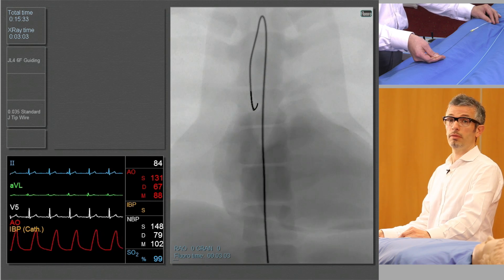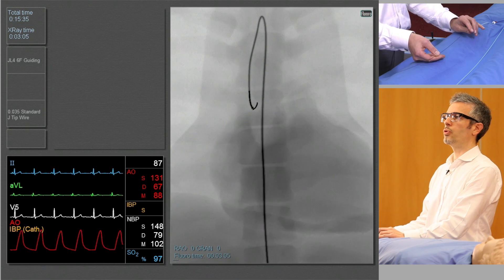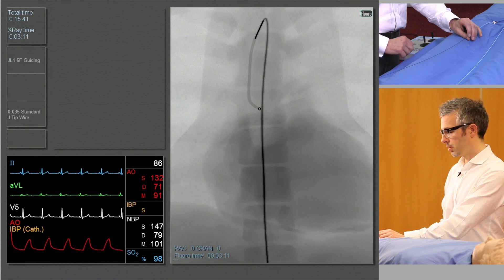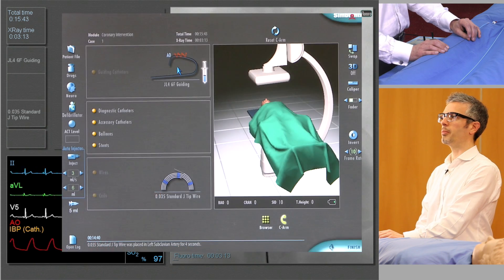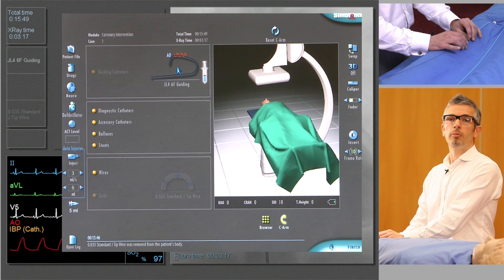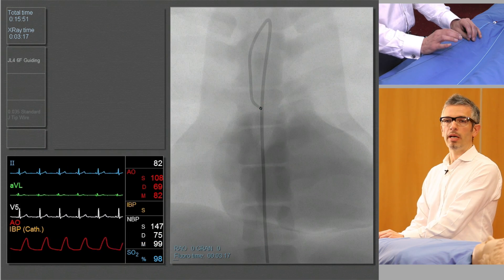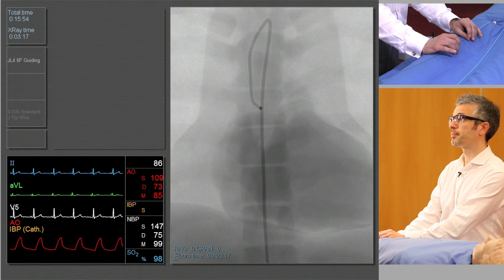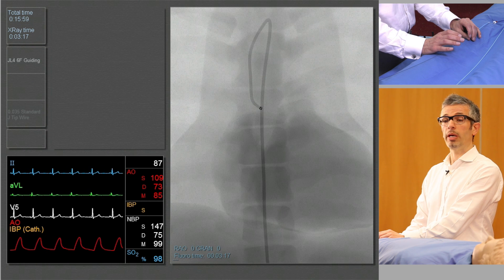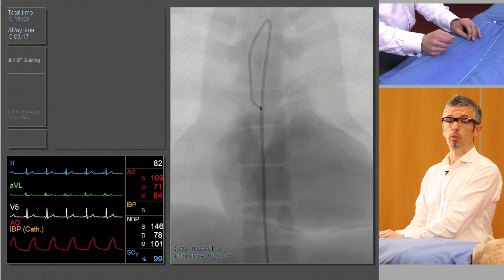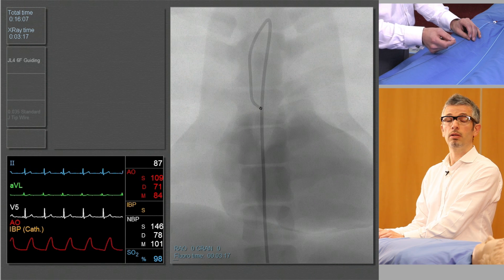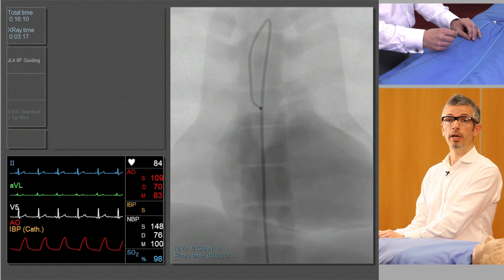Now that my guide catheter is in position, the next stage is to gently withdraw the wire, and that will allow the guide catheter to assume its proper shape. In a real case we would be connecting up our manifold at this point to enable us to inject some contrast. From here it's a simple case of talking the guide catheter into the left main ostium. There are only two simple movements: moving it in and out with the left hand, or rotating it clockwise or counterclockwise with the right hand.